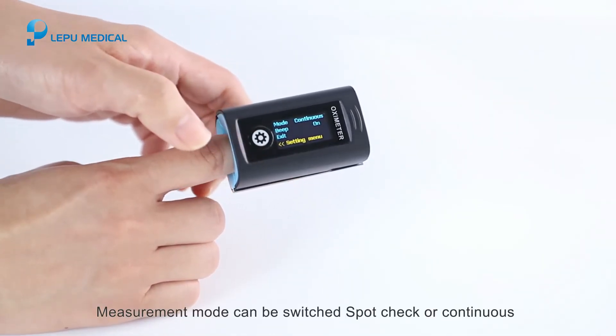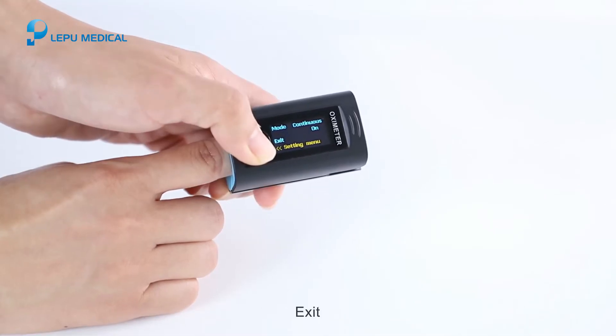The measurement mode can be switched between spot check or continuous measurement. Press exit to leave the menu.